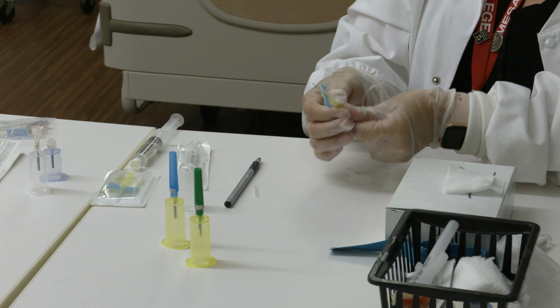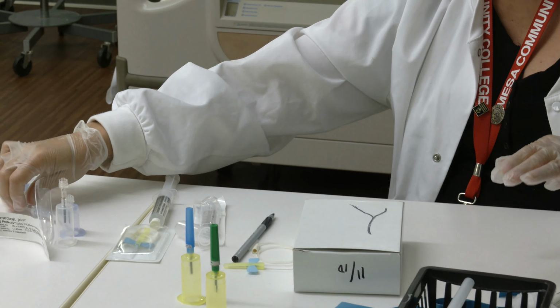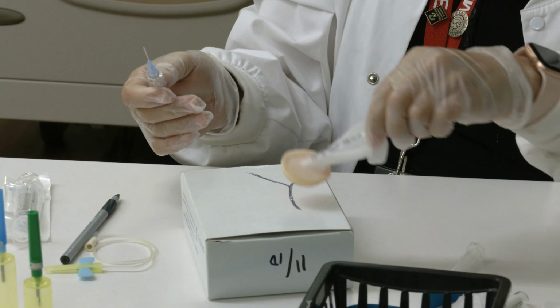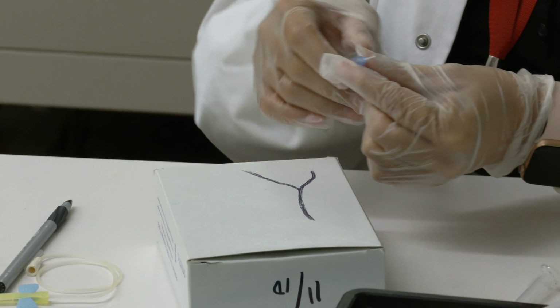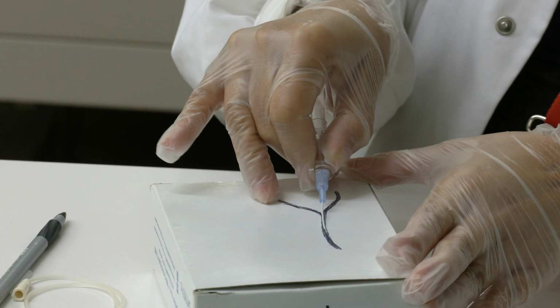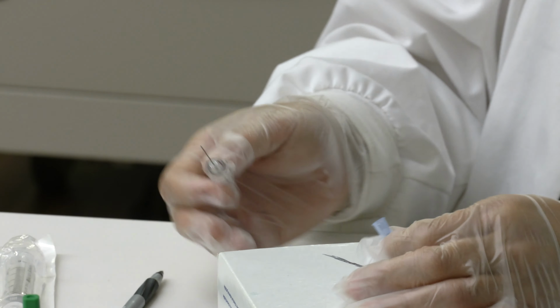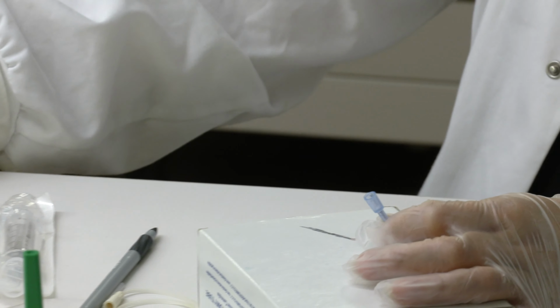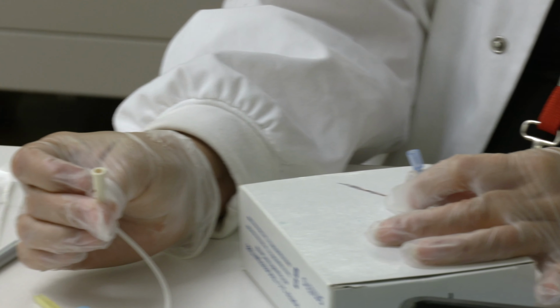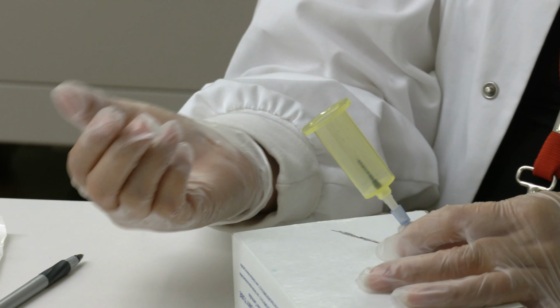Then we also have, if I put in an IV, when you put in an IV, you're going to do your tourniquet, do your cleaning, make sure it's all dry. When you go in with your IV, this one will be a little bit harder because it's not made to go into something quite so hard, and you pull the needle back out, then you'll end up with this blue piece outside of it. That allows you with the same end as the butterfly did. So you can use this piece, and you can put it in here and draw your labs.